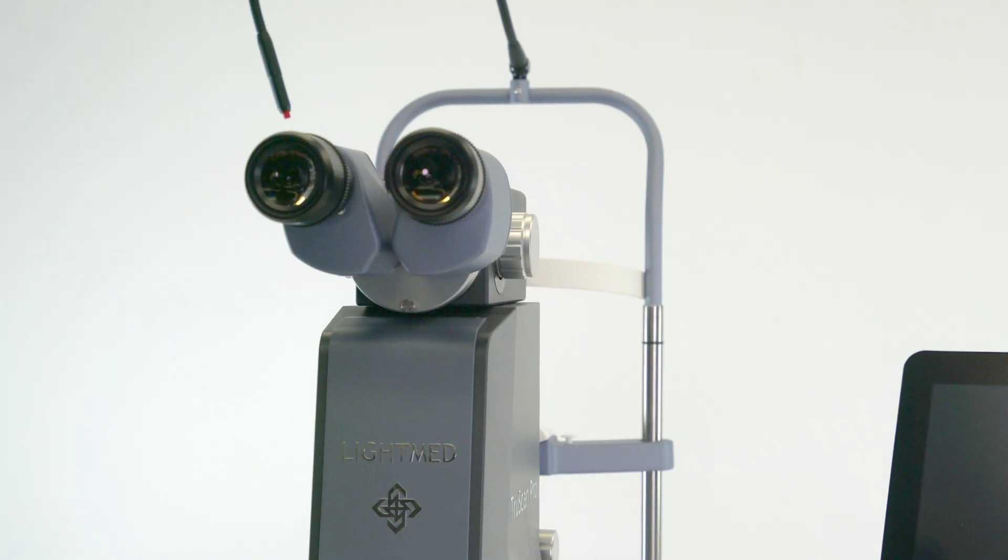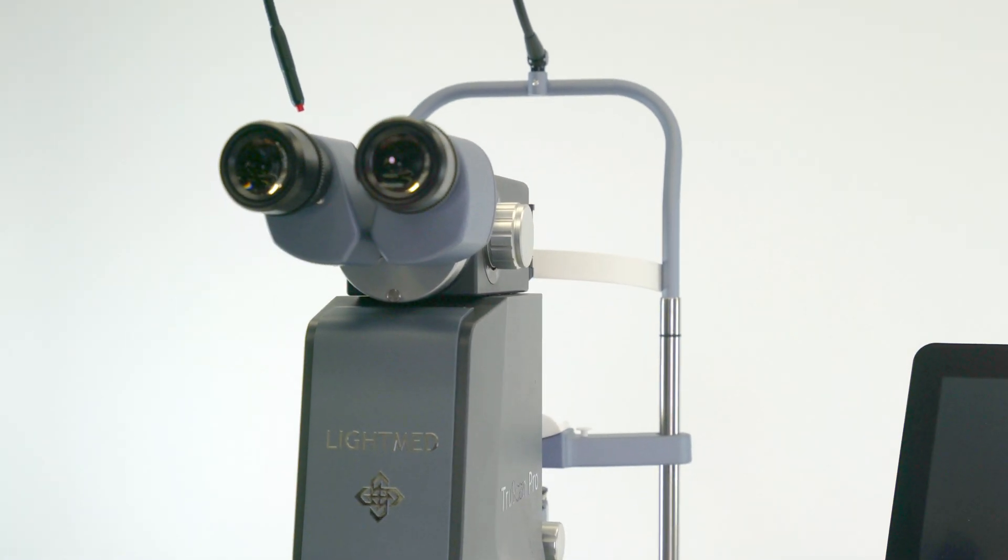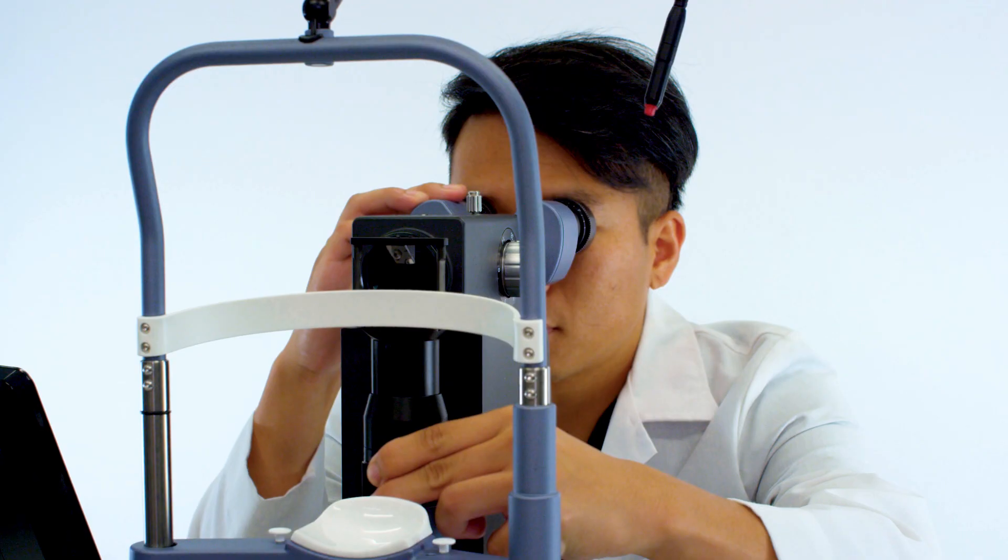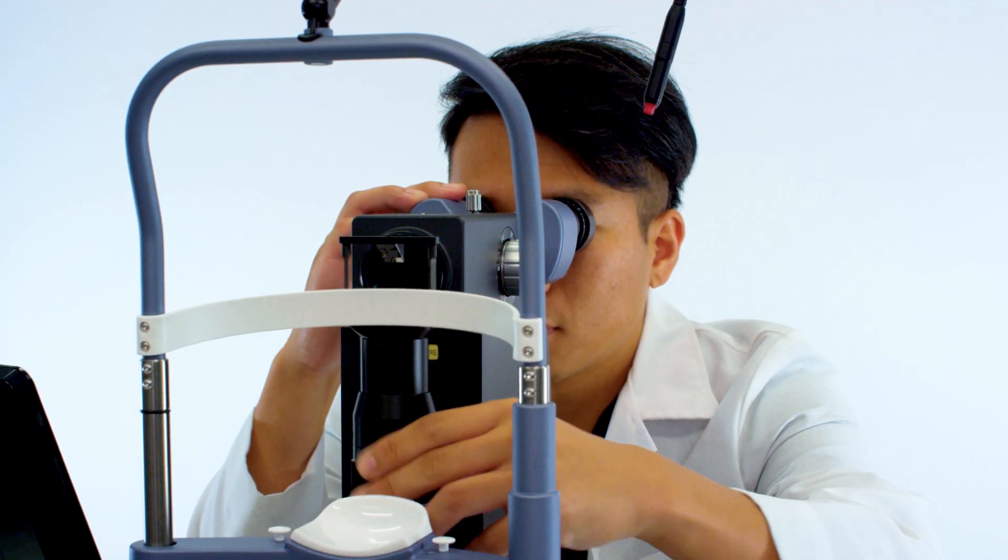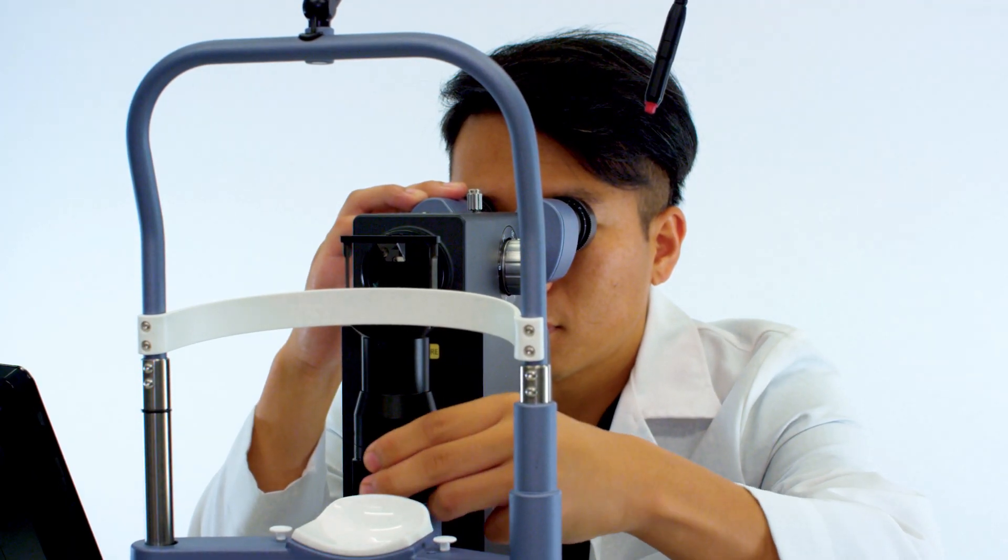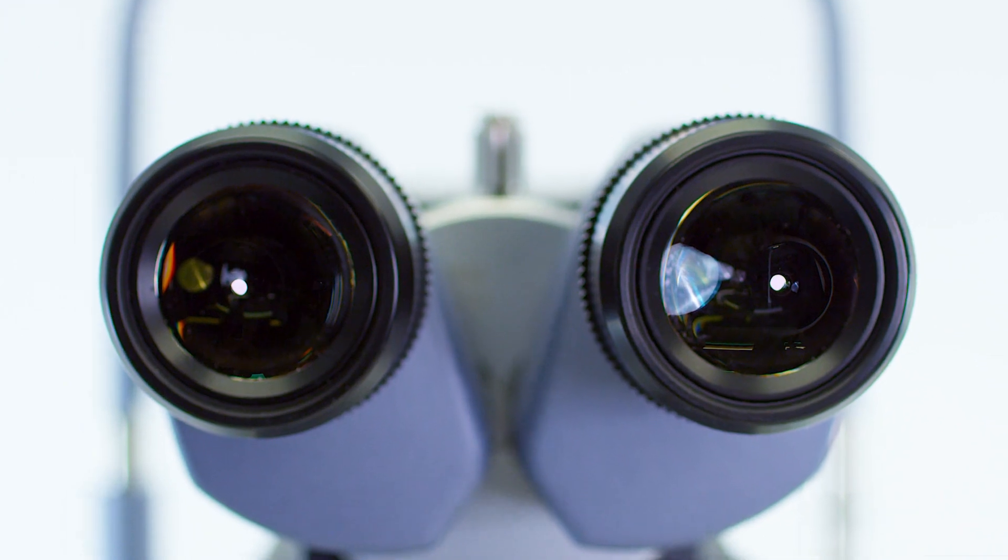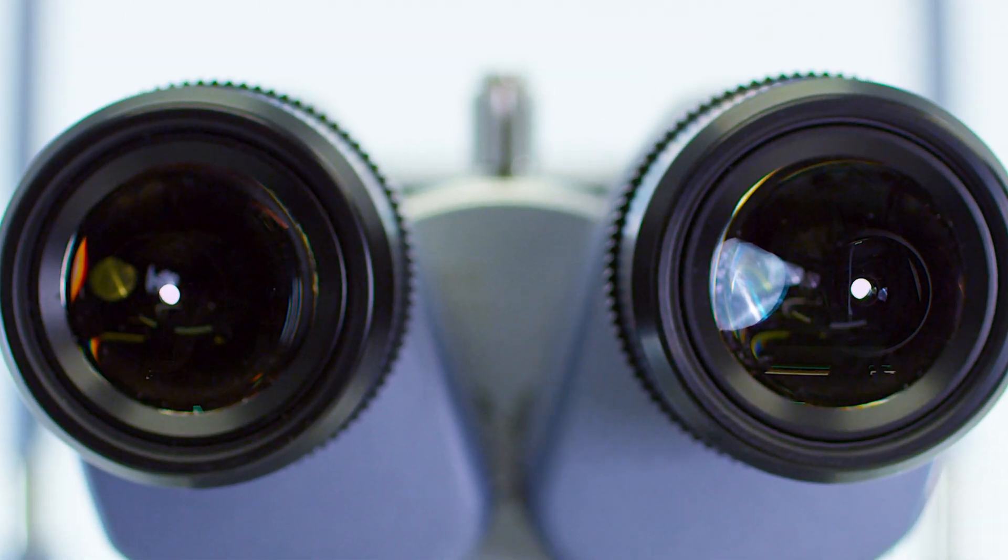The slit lamp is LightMed's newest and advanced design. It includes a world-class viewing system with excellent optics and has a built-in heads-up display to ensure focus remains on the patient during treatment.